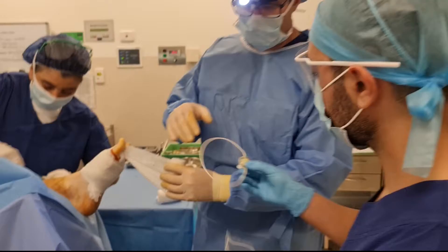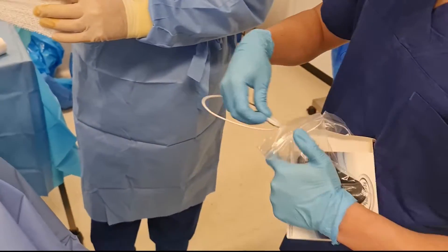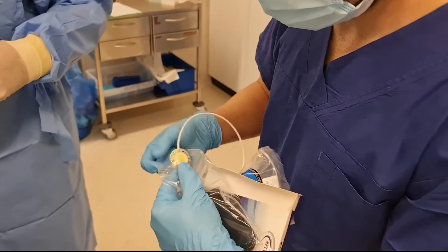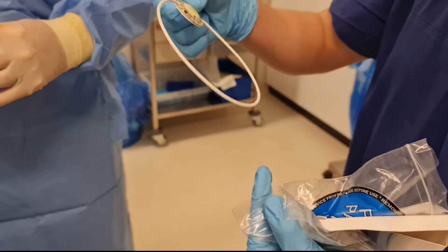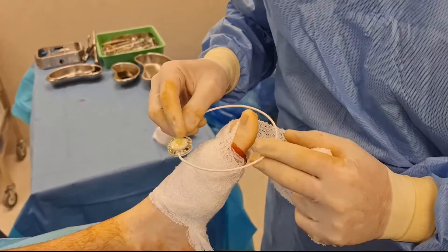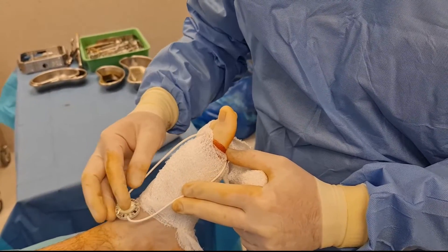So I'm just going to turn this one on. Now the green light is on, so that's ready to work. The patient will not feel any pulses. The surgeon can then place it in the area as desired. As long as the therapeutic area covers the site of the incision, this will be working straight away.